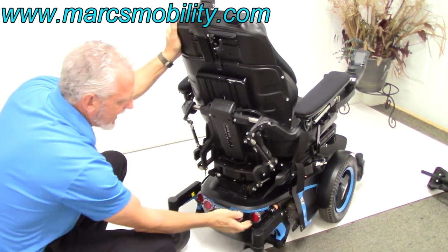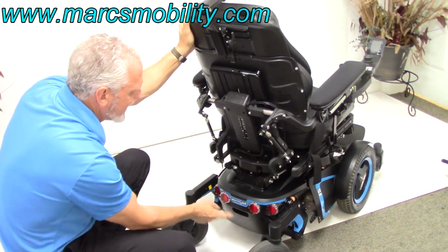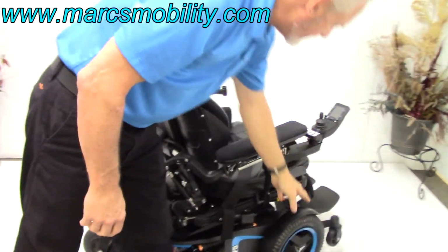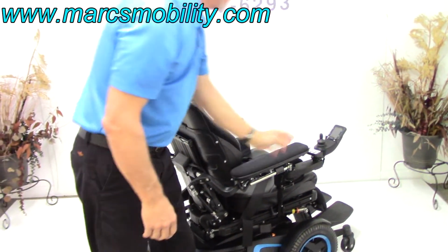Okay? These lights, they're reflectors only. They're not lights. So a lot of people ask me, how come they don't come on? These are reflectors. If you had lights on your chair, you would know it. If there was lights, there'd be lights on the fender. There's no lights on the fender, so all those are reflectors.